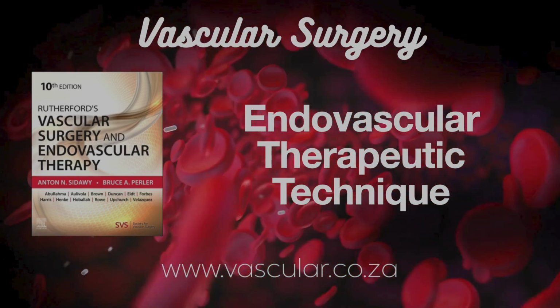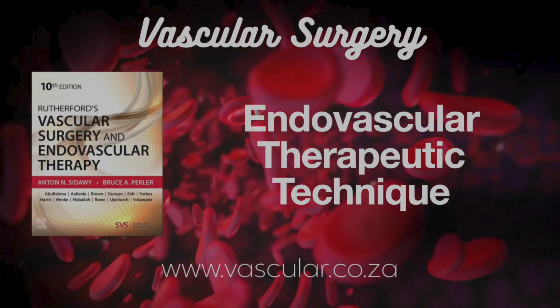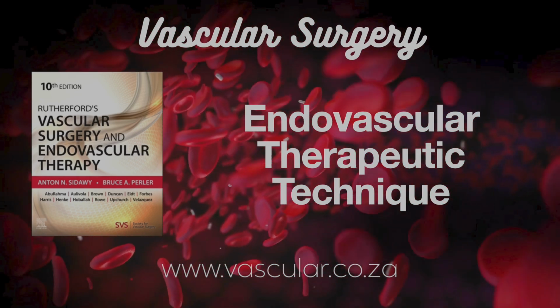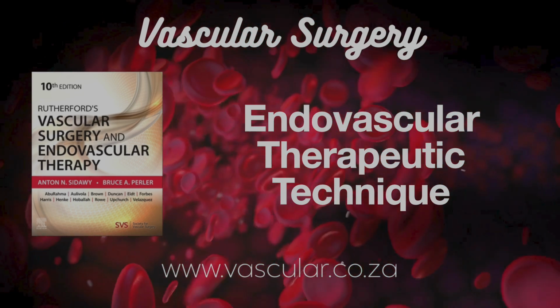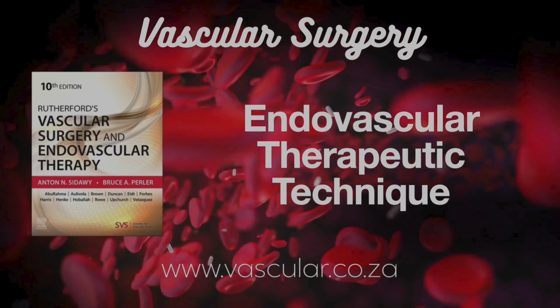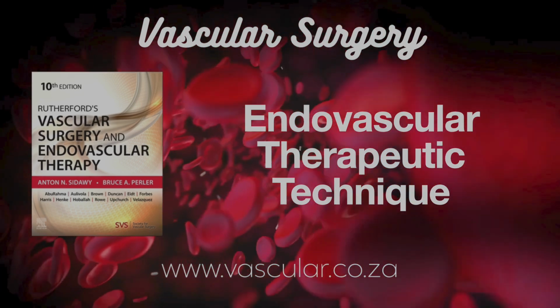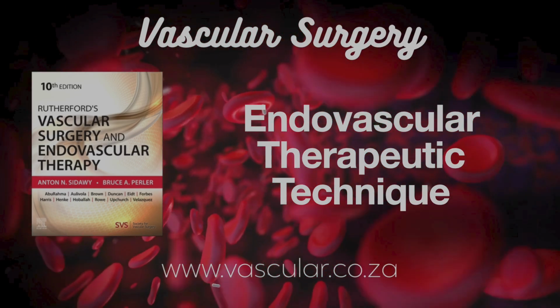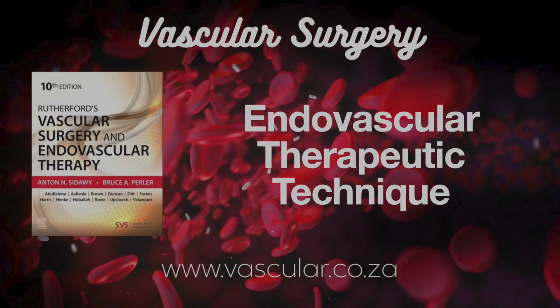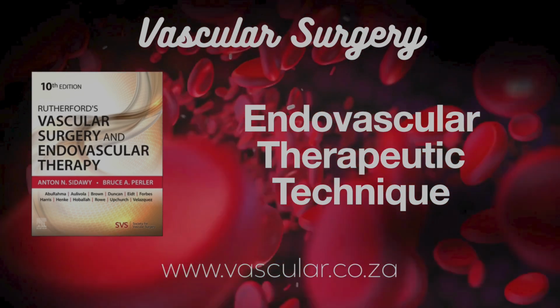Covered stents add a layer of material like PTFE, polyurethane, or silicone over that metal frame. And all these differences, material, design, deployment, affect things like flexibility, radial strength. Radial strength being the outward push. Right, how well it resists being crushed. Also, kink resistance, biocompatibility, all influencing how well it works long term.